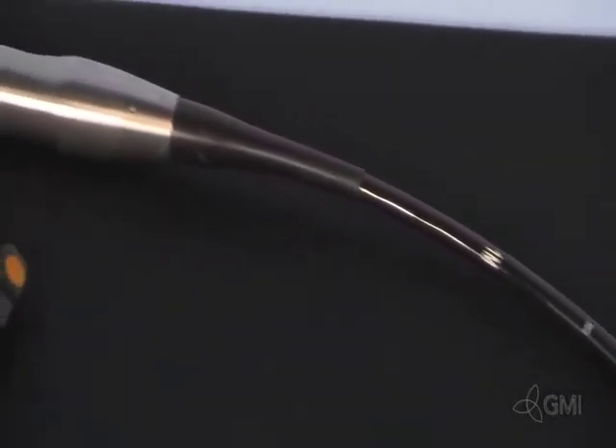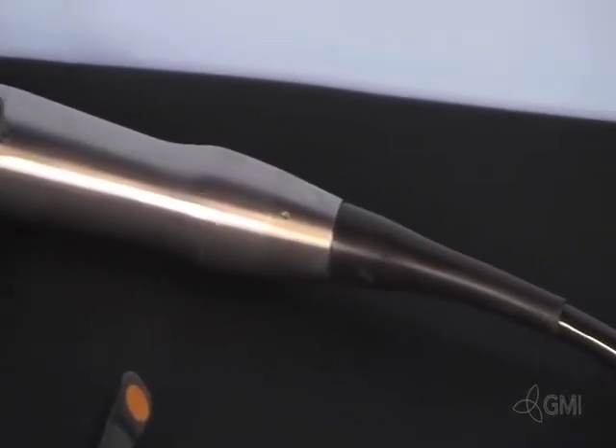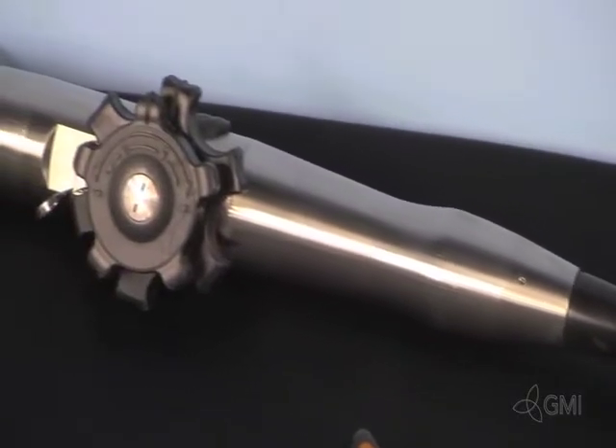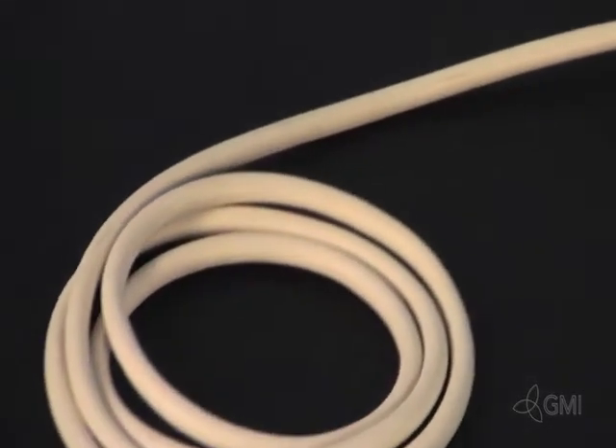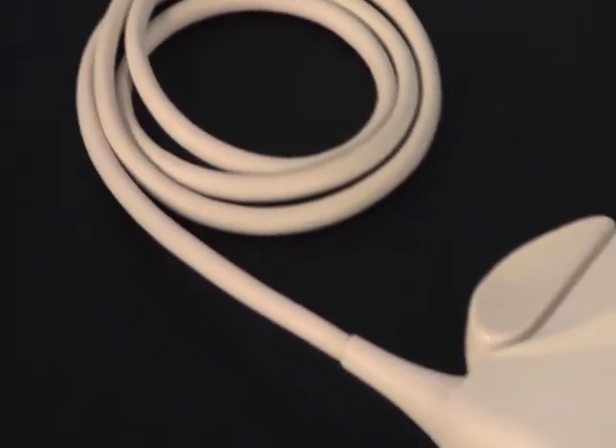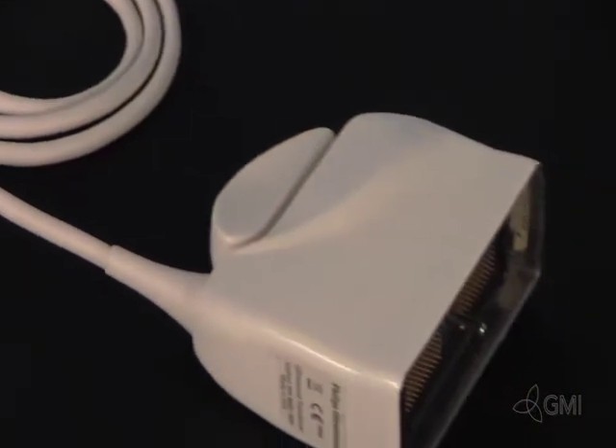The probe is very recognizable due to its size and design. It consists of the tip housing and transducer, the bending neck rubber, the insertion tube, strain relief, control housing, cable, and connector.